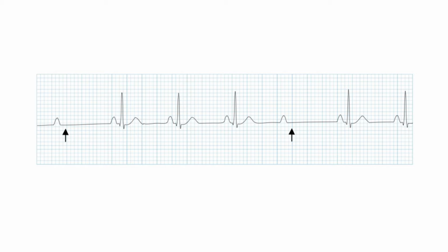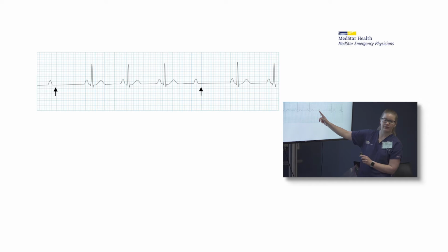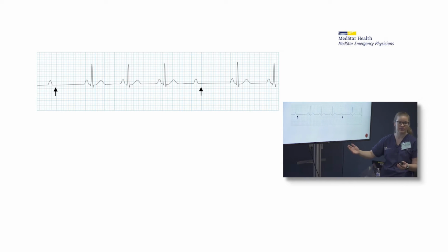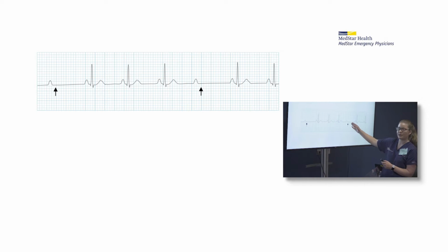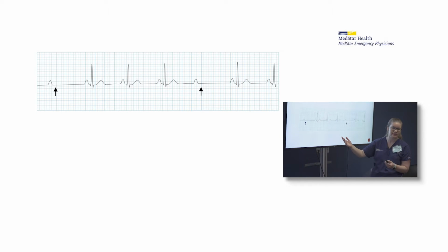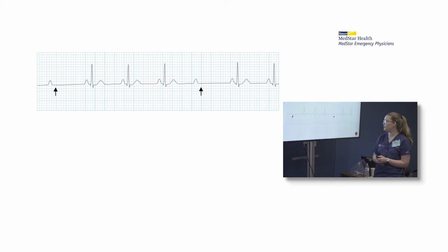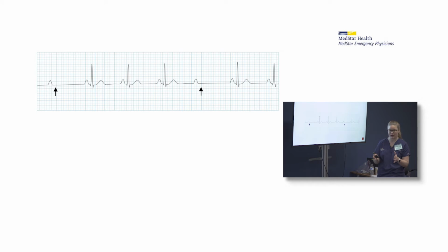No, you've got a P wave here. Okay. So a sinus P wave here. P wave here. Here. P wave here. Okay, your PR interval. You think it's less than 200? Yes. Okay. And then here we don't have a PR interval. We don't have one. Yep. And then your QRS less than 120. Less than three little boxes. Yes. Good. And your QT. Less than 500. So less than 2.5 of the big boxes. Okay, good.